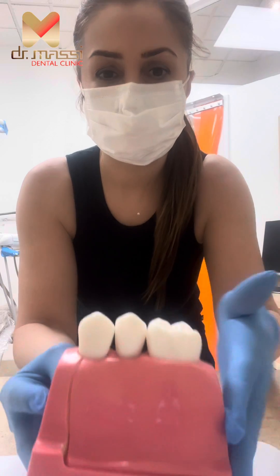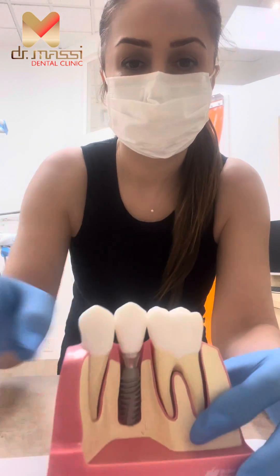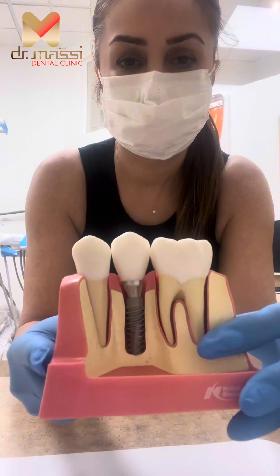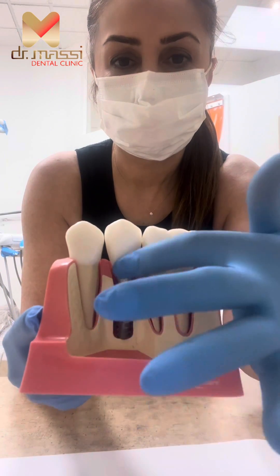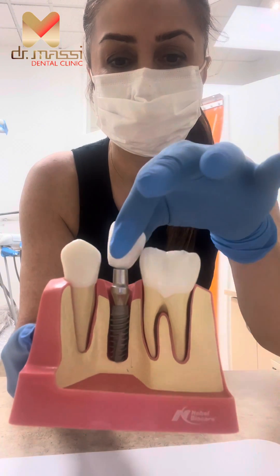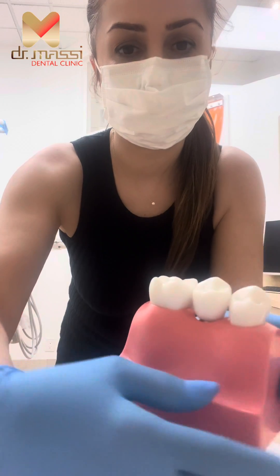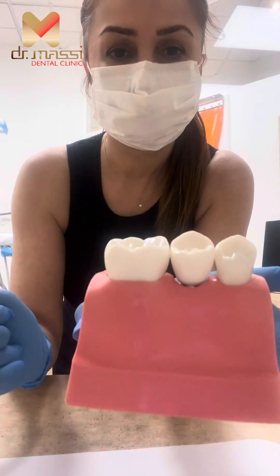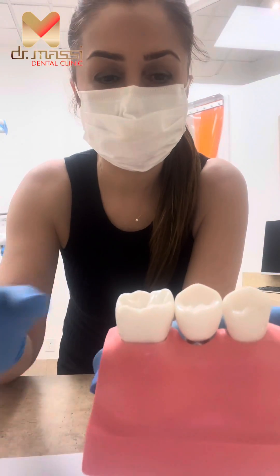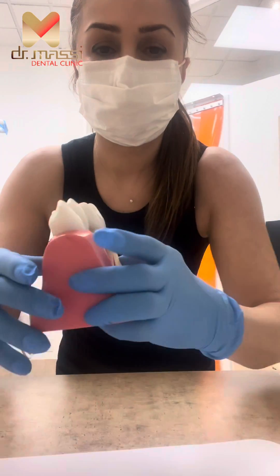Now if you look at the missing tooth in the middle, you're going to remove that one — you see the bone, you see the implant in the middle, and you see the two crowns on the sides, the top ones. Now if you remove the crown and look at the other side, it looks exactly natural, and it doesn't show you have a fake tooth. Actually, the middle one is a crown on top of the implant.